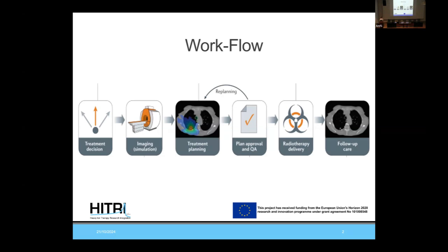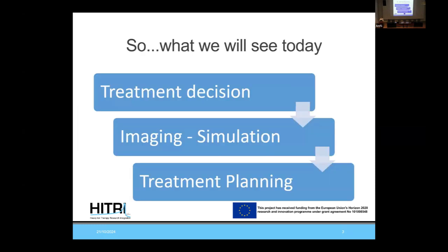If it is not okay, we have to do it again. After that, again QA, and after that radiotherapy delivery, and the doctor follow up, to see what's going on. So basically, what will I discuss today? The treatment decision, the imaging simulation, and then treatment planning.